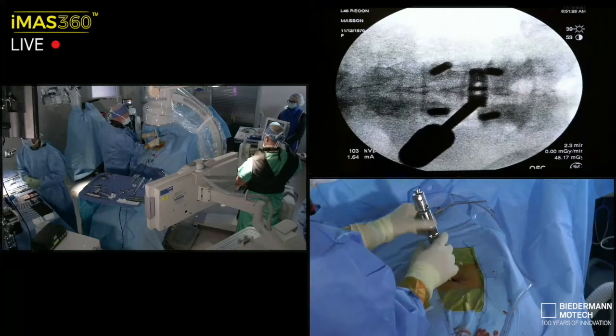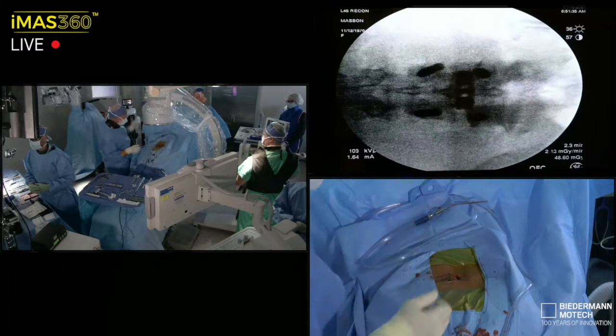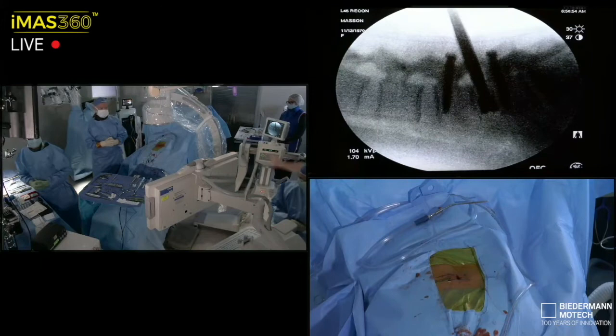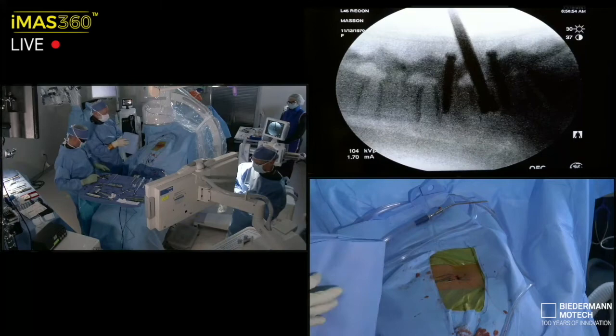All right, that looks good. So I'm going to just simply remove that. So I've got a nice placement of the cage right there, L4-5. So good. We're done with the interbody phase of the case. Now we'll move on to the most important, most critical, most relevant part of the case, which is a well-done microsurgical decompression, left L4-5 to L5-S1, cross midline internal laminectomy, right L4-5.